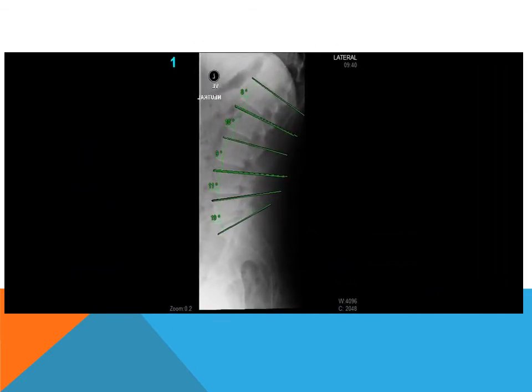So here on the same lateral lumbar radiograph, I measured the lumbar lordosis. It was 60 degrees. I've now measured the intersegmental angles by drawing a line first from the superior end plate of L1 to the superior end plate of L2. That angle measures -8 degrees. And by the way, doctors, you need to be very careful of your pluses and minuses. Minus degrees indicate that the angle is in extension. It's in a lordosis. A negative angle indicates extension, lordosis.